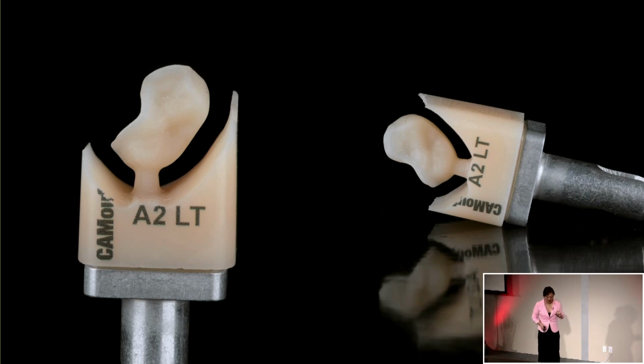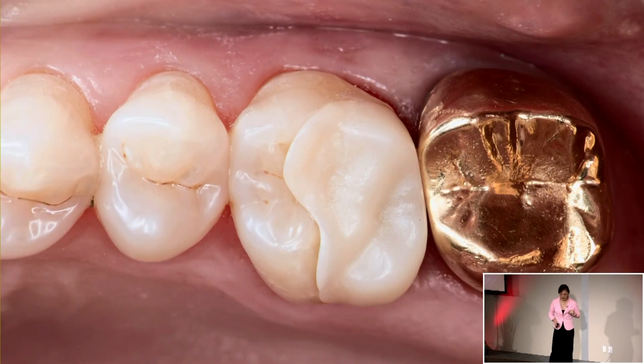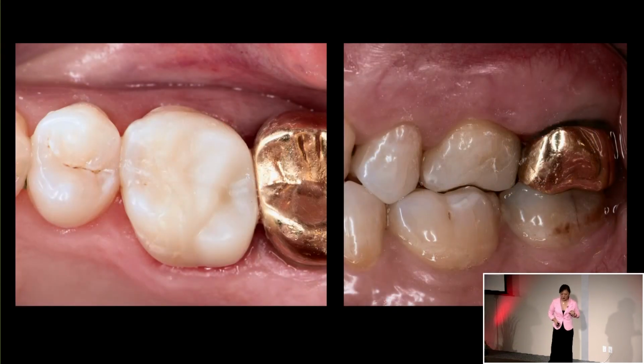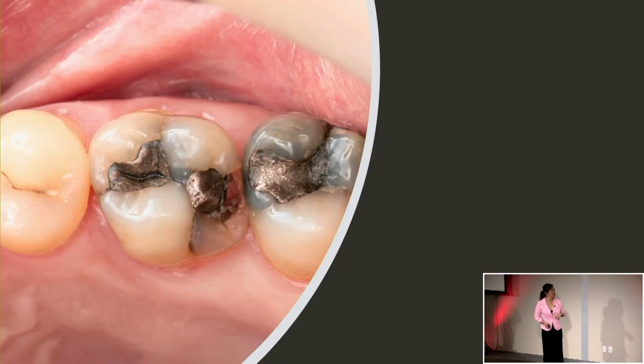And this is how it came out in less than, I think this one was less than 7 minutes. I do a passive try-in, seating down very nicely, and I went ahead and used the bonding protocol, and the case came out very nice. So here's Mark before and after, and I do like to take an x-ray just to verify the fit.